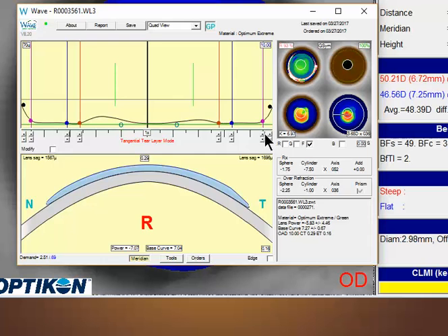Now don't forget, it sounds like your other lens was comfortable, so you probably had adequate tear exchange. This one's going to be a little snugger, so you want to make sure you raise up that pink dot enough, maybe a few clicks here, just to promote enough tear exchange on that lens.